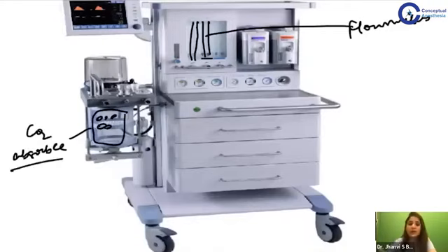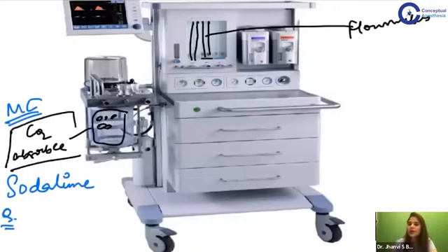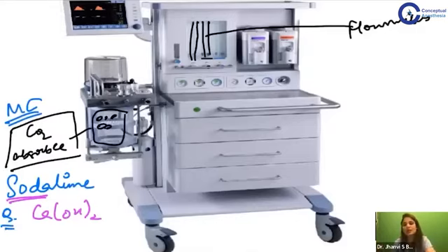So they will ask you in the exam, what is the most common carbon dioxide absorber used? And this you should know. The most common carbon dioxide absorber that we use is called soda lime. Second question that comes about a carbon dioxide absorber is, what is the main component of carbon dioxide absorber? The main component is calcium hydroxide. Okay, many of you will see soda lime and answer it as sodium hydroxide, but no, the main component of carbon dioxide absorber is calcium hydroxide.